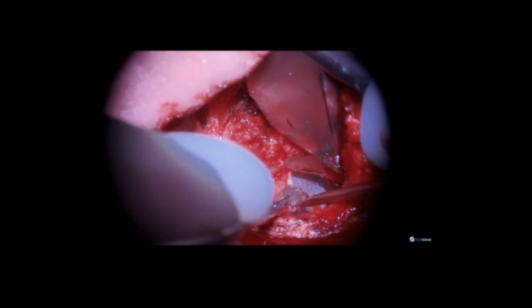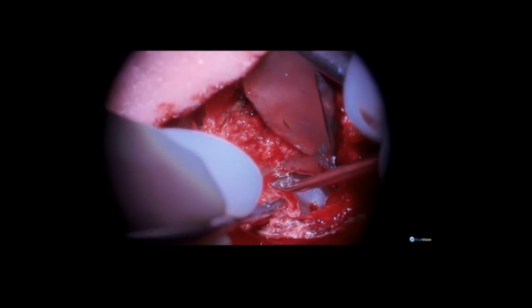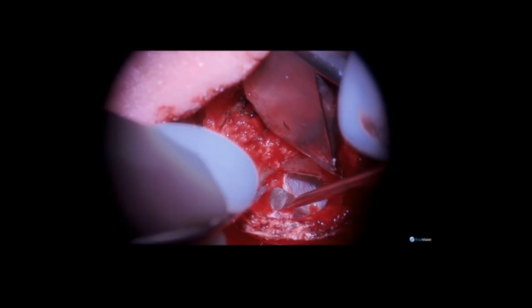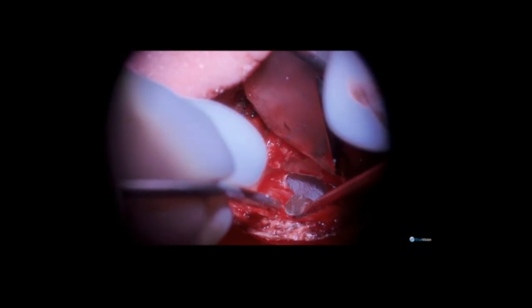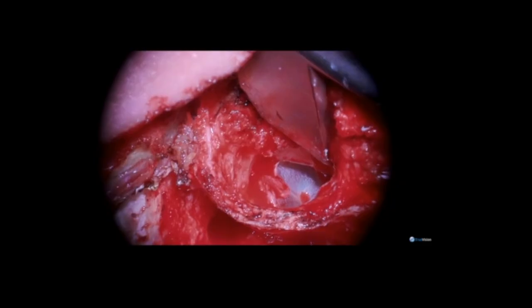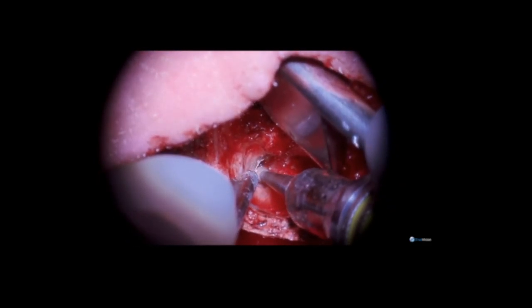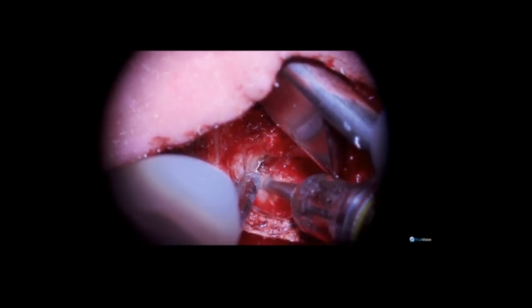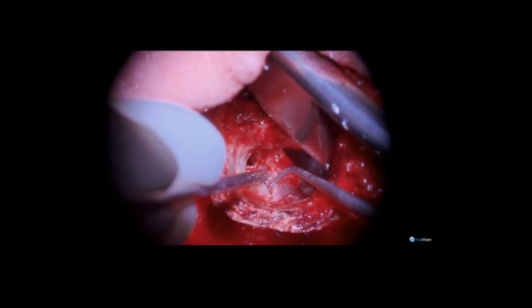This is particularly important because we want to gain access to the anterior superior annular ligament and raise it up in order to get a good underlay in that region. This is particularly important as well so that I can use a small diamond burr to just gently remove some of the scutum bone to get access to the anterior superior attic region, which is an area of high rate of recurrence if not performed properly.